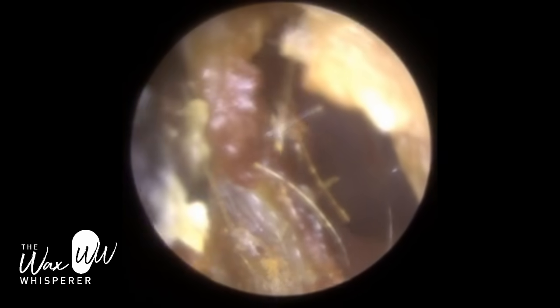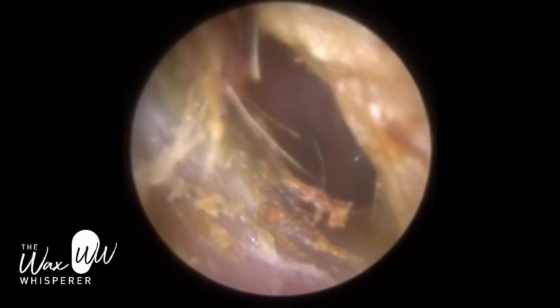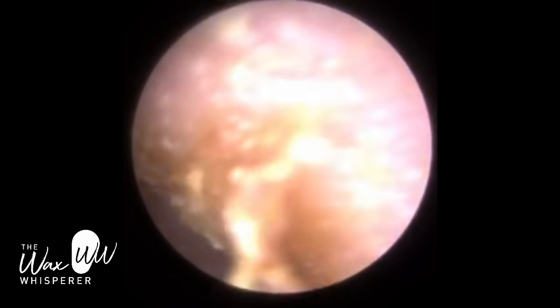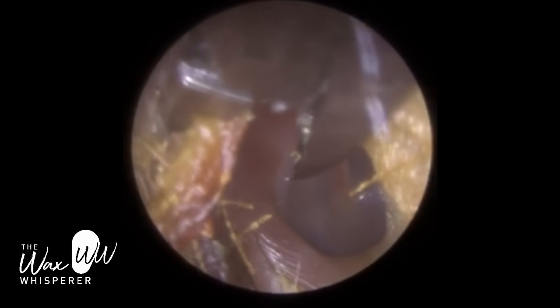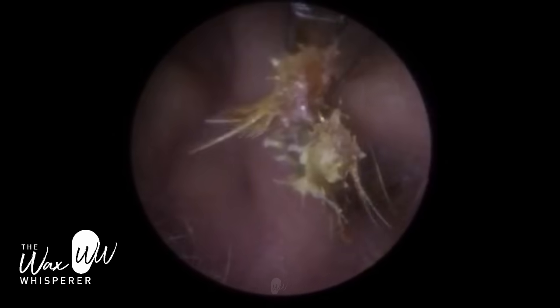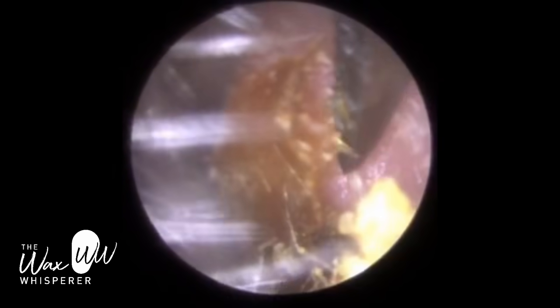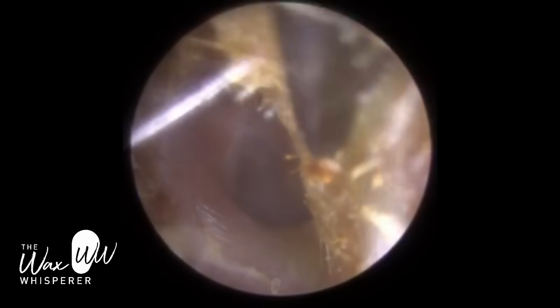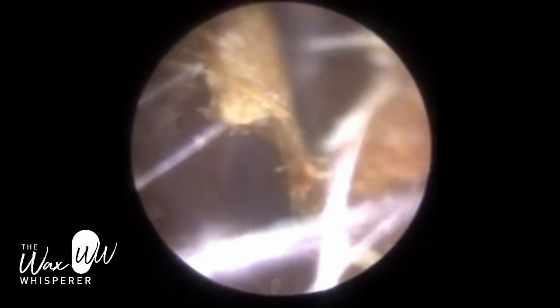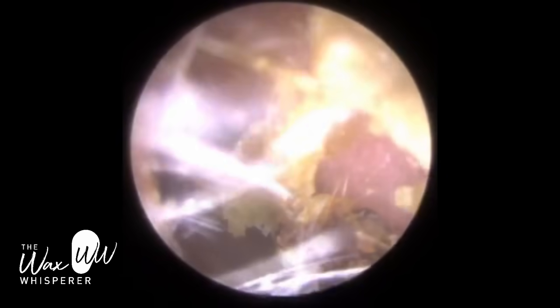Just using a Jobson horn now, just trying to separate this dead skin. There's some keratin dead skin on the posterior and anterior canal walls - on the back part of the ear canal and the front part of the ear canal - and attached to that is some wax. So I just tried to lift that, separate that off the canal wall. And I'm using some forceps now to get some patches and extract this. I've managed to get some dead keratin off the posterior canal wall - that's the back part of the ear canal. Now there's some dead keratin adhered to the front part of the ear canal, the anterior part. It's quite lateral - near the entrance.